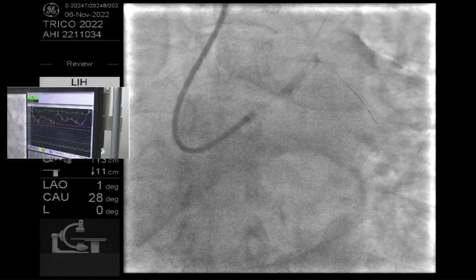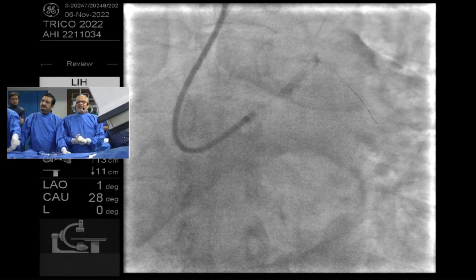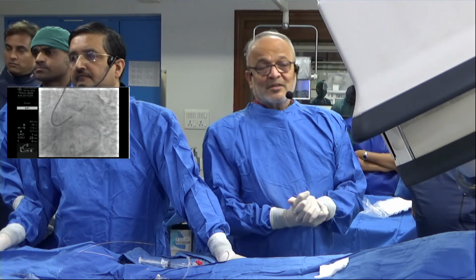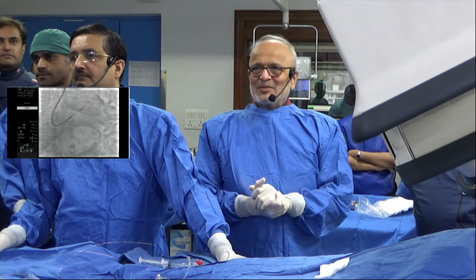You know what? For vasovagal or this type of hypotension happening in the cath lab, we feel that it is a cardio inhibitory response, and most of the time people give atropine. But I always feel that in the cath lab it is a vasodepressor response and adrenaline works more than atropine. I want to know what you guys are doing. Yeah, I think this might just be pure vasodilatation from the drugs. So adrenaline might work very well.